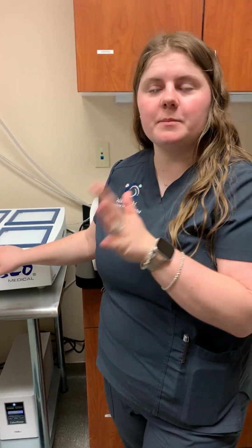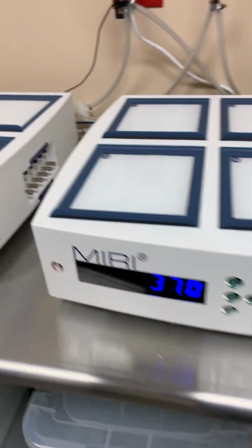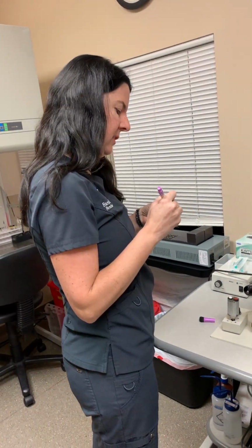Now we have a question from Alicia, who is asking, do the embryos also go to those when they are thawed for an FET? Yes, they do. So anything that's being cultured for any length of time, so your FET, if it's a blastocyst, is thawed that morning, but it will sit in here for a few hours to allow it to re-expand and hang out in the culture media prior to your transfer. At the time of your transfer, it's moved into a transfer media, and then it's transferred to your body. So yes, they are also kept in here.